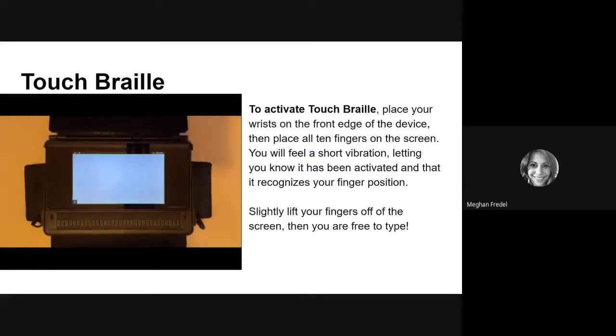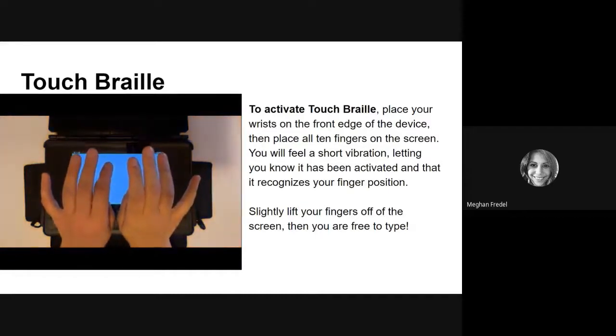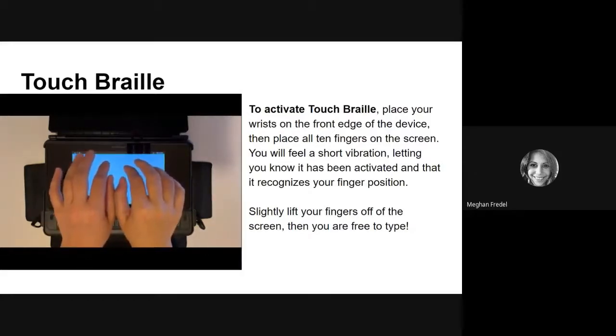Next, I'm going to show you how to use Touch Braille. It's very simple to activate. All you have to do is place your wrists on the front edge of your device, and then place all 10 fingers on the screen. Now it's important that you put them on the screen in a way that feels comfortable for you when you use Braille, because it's going to recognize where your fingers are, and that's how it's going to determine what letter you're trying to type. So this does take some practice.